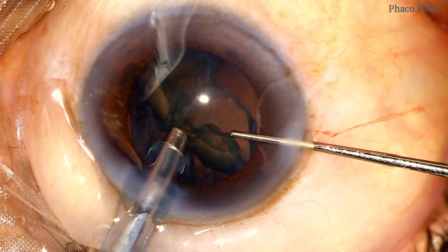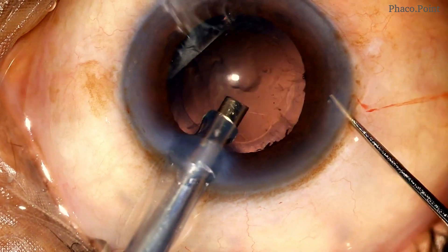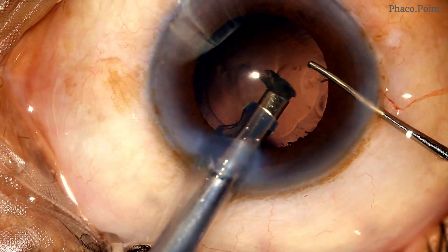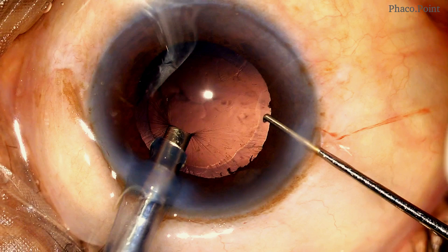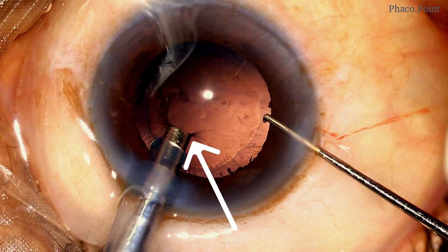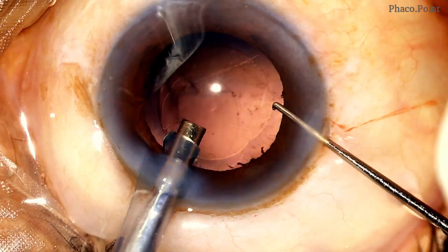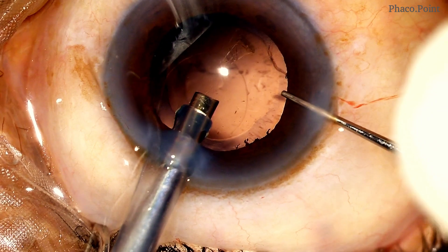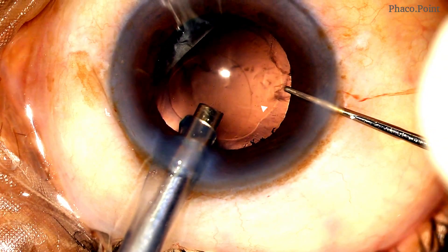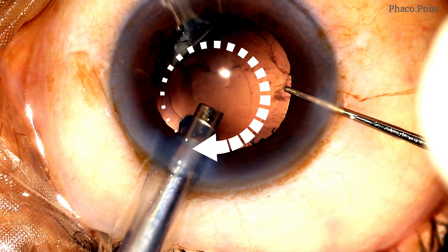Towards the end of the epinucleus removal, whilst I'm about to get the last bit of epinucleus, I accidentally hold on to the posterior capsule. You can see the radiating folds in the posterior capsule. When I release it, unfortunately it creates a punched-out tear in the posterior capsule.